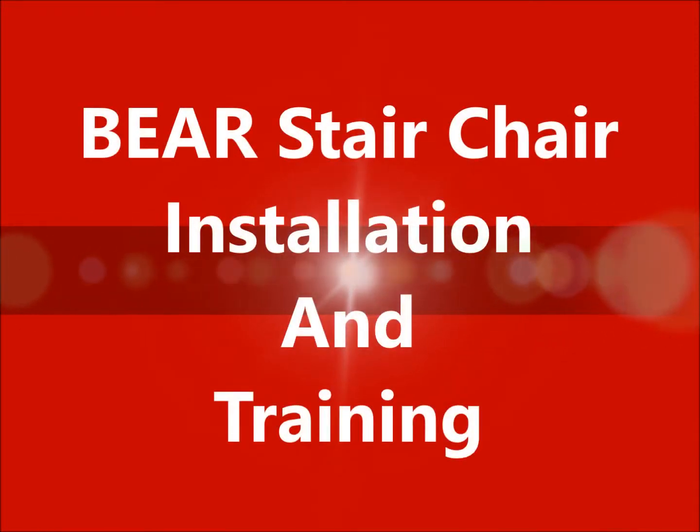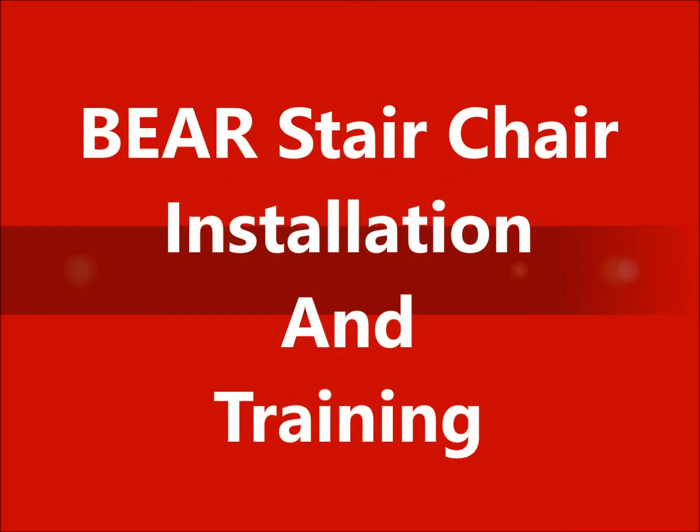For demonstration purposes we have chosen the Ferneau stair chair. Keep in mind our bare stair chair will accommodate both Stryker and Ferneau.